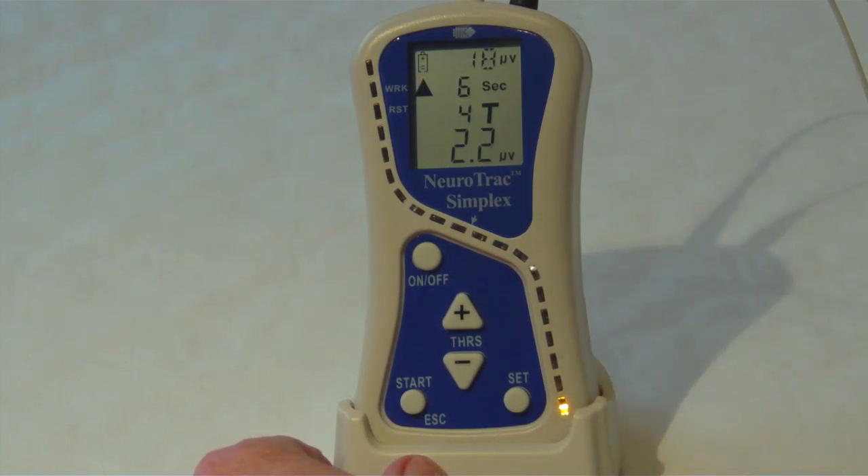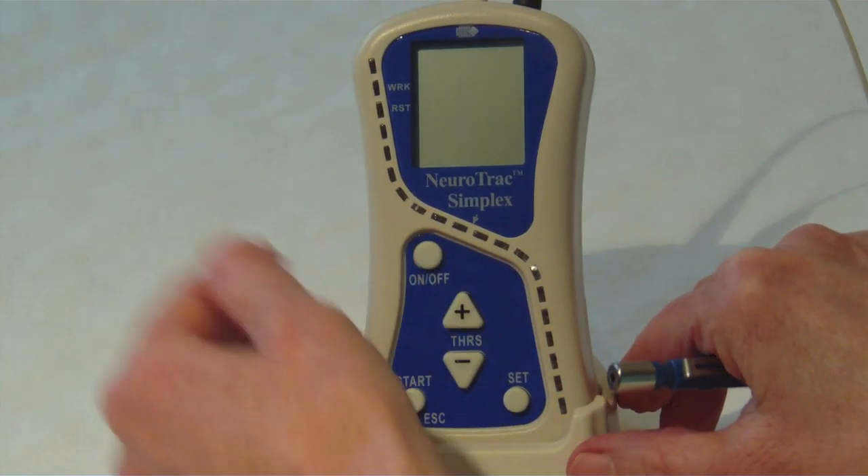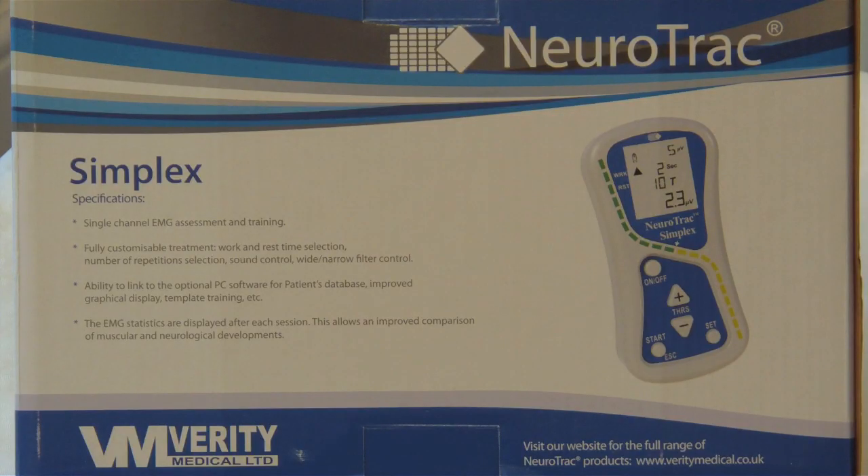When you switch the unit off the settings will be saved, ready for you to repeat the same biofeedback session next time. The Neurotrack Simplex is a biofeedback unit that allows you to assess the strength and condition of your pelvic floor muscles. Biofeedback can be done in lying, sitting or standing — it's a really good way to keep motivated and monitor your improvement.